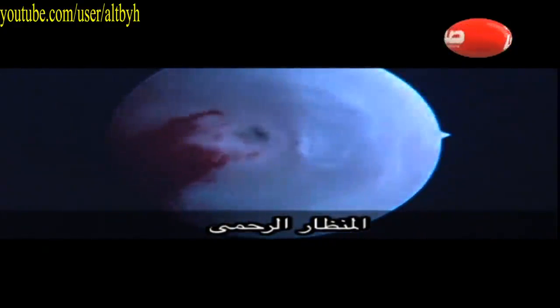This is another subseptate uterus, in a lady with a previous history of recurrent miscarriage, and this was treated successfully.